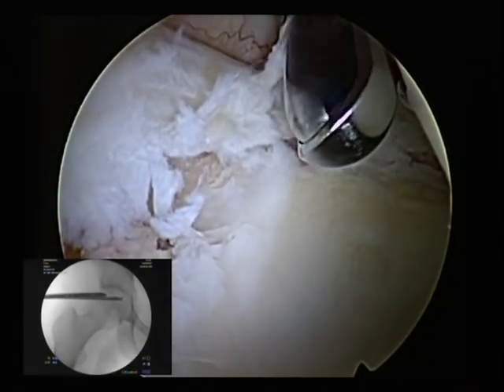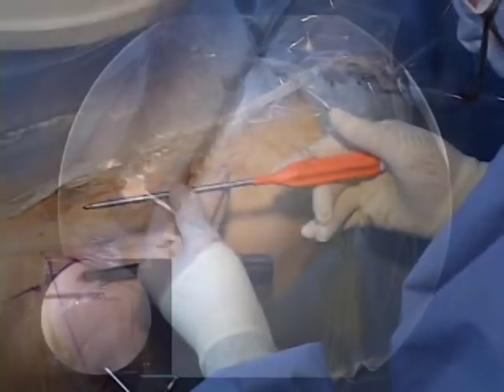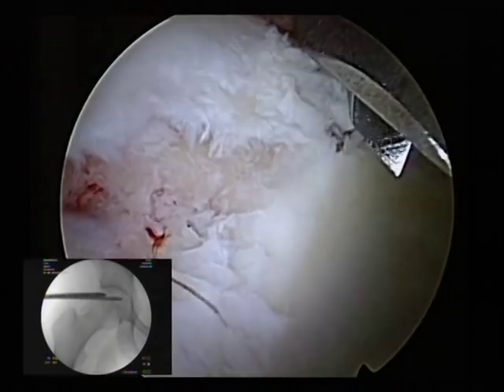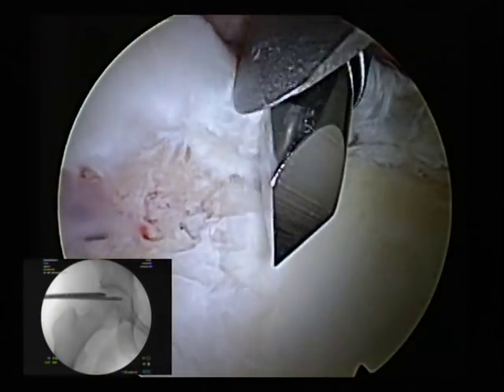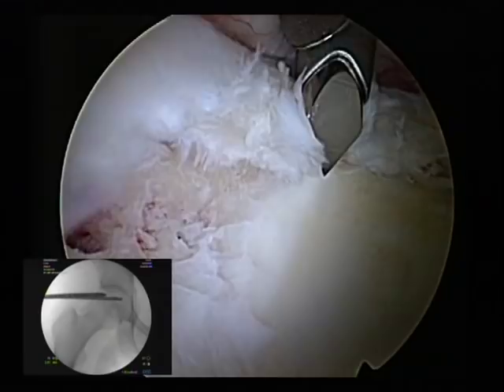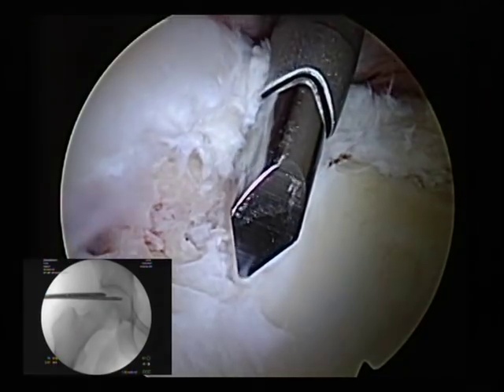We have to be very careful here not to finish this tear circumferentially, otherwise the repair is not going to be good. This is the hip-specific guide for the 3.5 millimeter push lock — it's a little bit longer. It makes hip arthroscopy or hip labral repairs a little bit more predictable. What we'll try to do here is slide this, thinking about where my suture ultimately is going to be, and we need to work around where the drill is going to go.